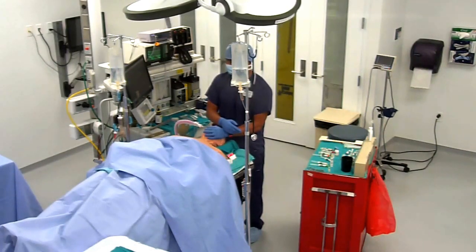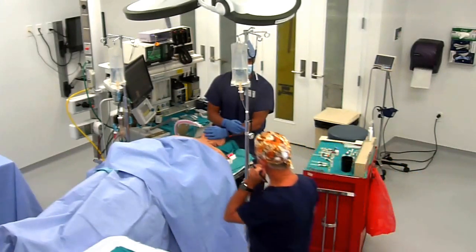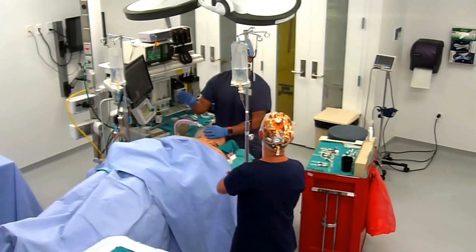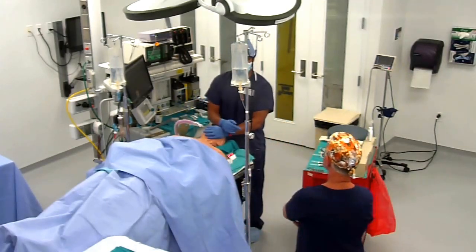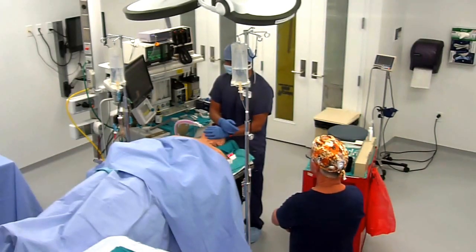Okay. And you do that, and let's say you've turned off your sevo, right? You tell me? Yes. Okay. And probably turn up my rate a little bit, help breathe it off. Okay, good. So you're on 100% oxygen now, and you've reversed your muscle relaxant.